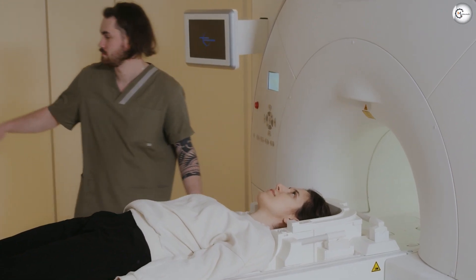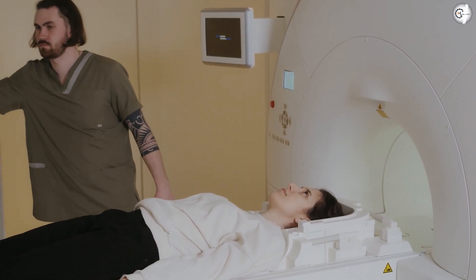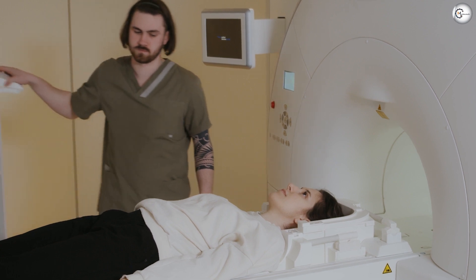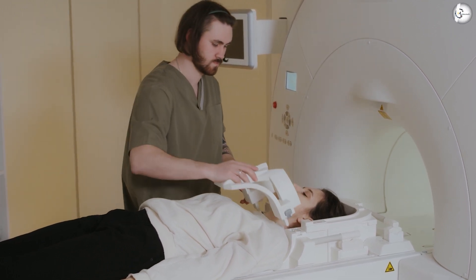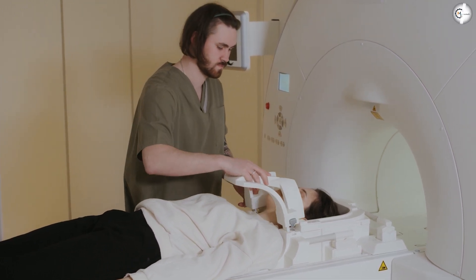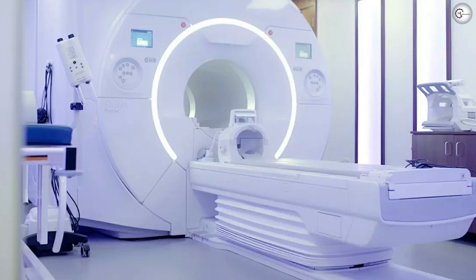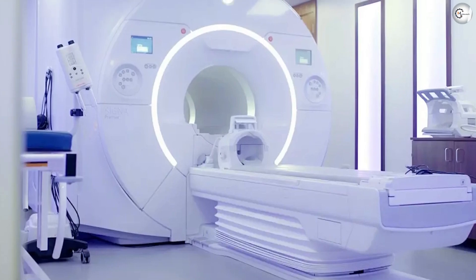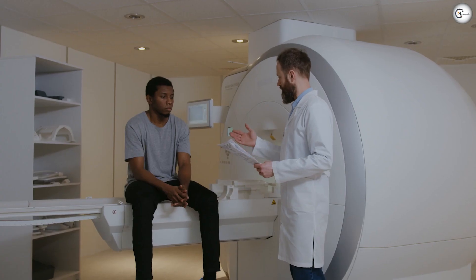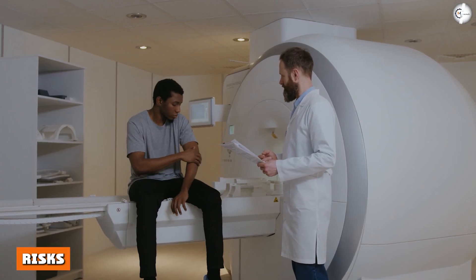CT scans are more widely used than MRI and are typically less expensive. MRIs, however, are thought to be superior in regards to the detail of the image. The most notable difference is that CT scans use x-rays while MRIs do not.